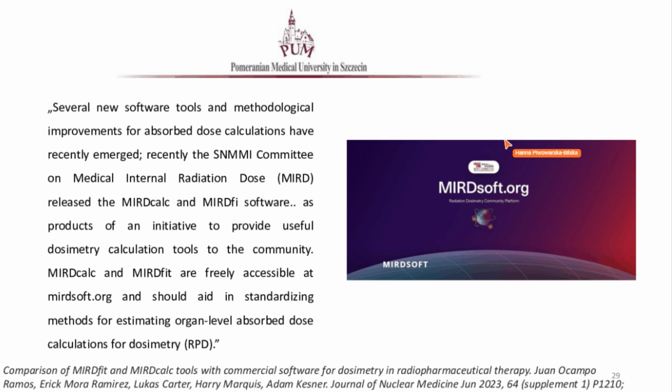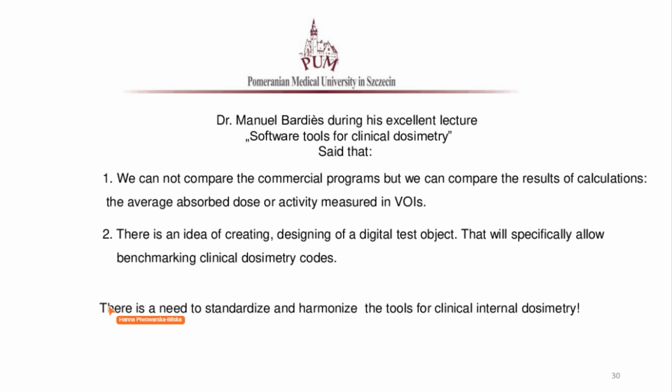MIRDcalc and MIRDfit sheets are available free of charge at the mirdsoft.org website. They are helpful to standardize methods to calculate the absorbed dose at the level of the organ. All the calculations are made in Excel, so such programs can be used to verify the dosimetry calculations provided by commercial software used in your nuclear medicine departments.